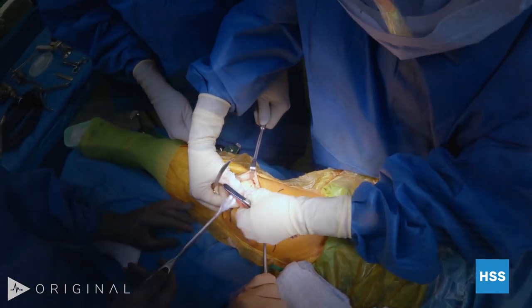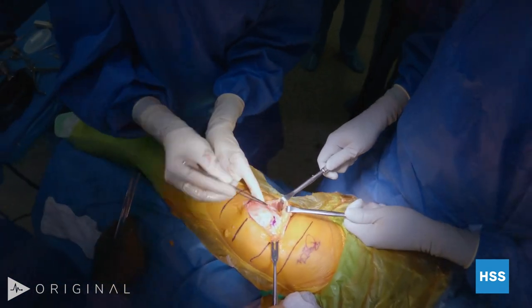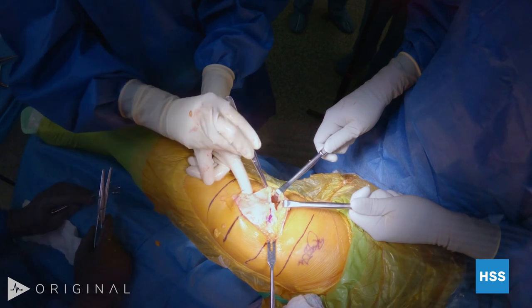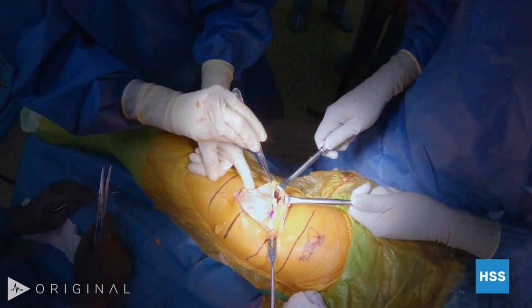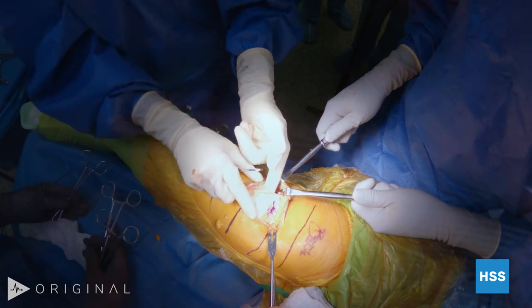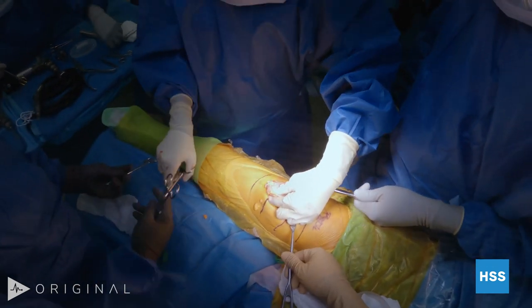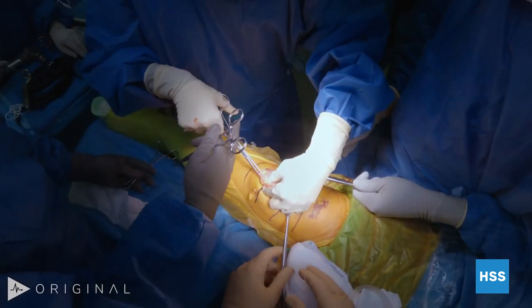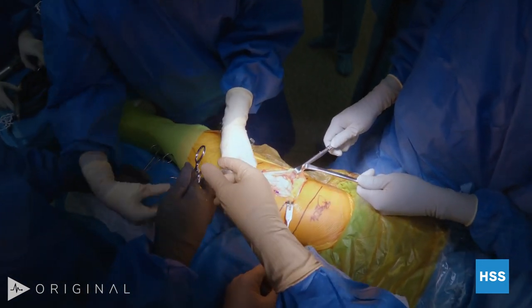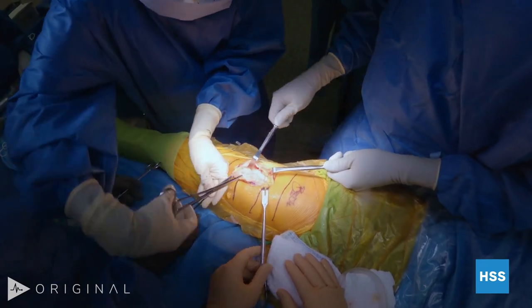We're going to flip that patella. This is the piece of tissue that we lengthened — that's what we'll close at the end, and that's what gives us the extra length when we slide it against the retinaculum. It doesn't look so impressive, but at the end of the case it's nice to have. It prevents you from having to devascularize both sides because you're not going through the medial side, so you're preserving blood supply.